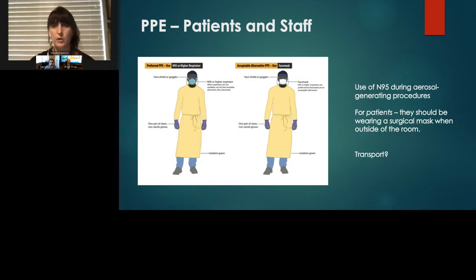So I really encourage people, when you're looking at your staffing and your PPE needs, to consider workflow. And that's a really challenging piece to this. So you have to make sure anybody that's going to be in the room during aerosol generating procedures or within an hour of them has that N95. Are you doing extended use? Are you using UV disinfection, or whatever disinfection, to have extended use of those after the shift?